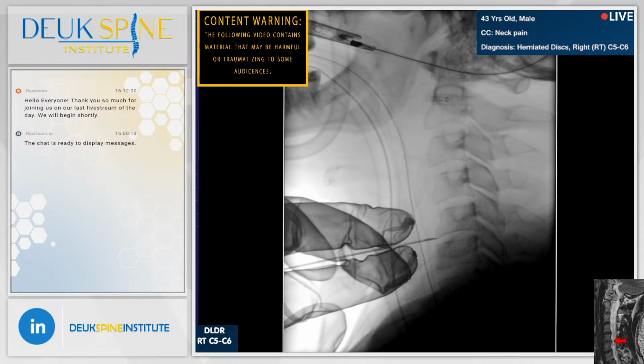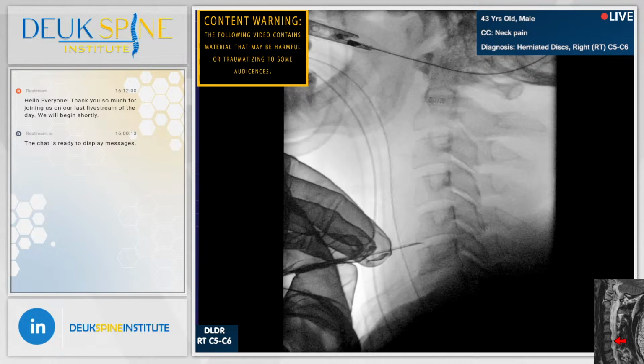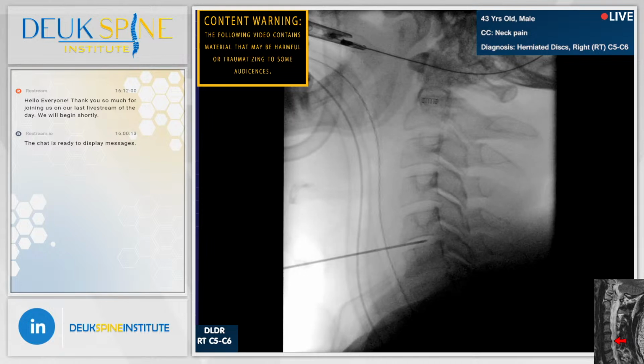All right. So I'm right here at the front of this disc. Shot. I've got to get into the disc. I'm going to advance my needle. Shot. Shot. Perfect. And one more.